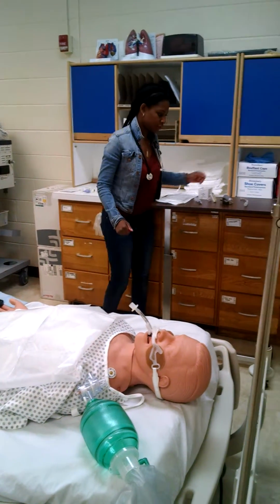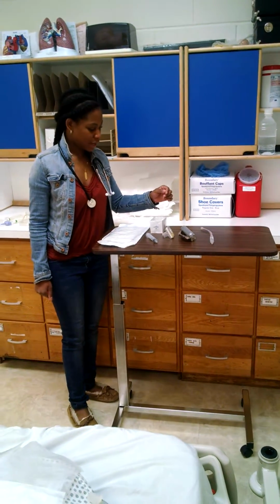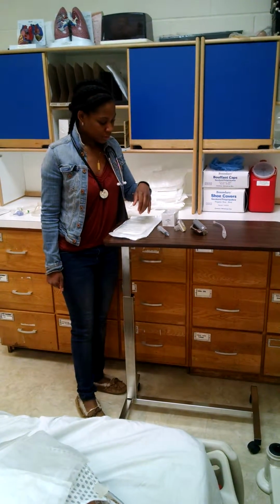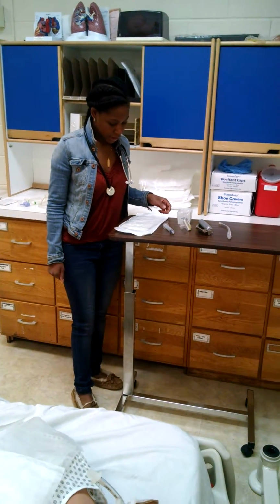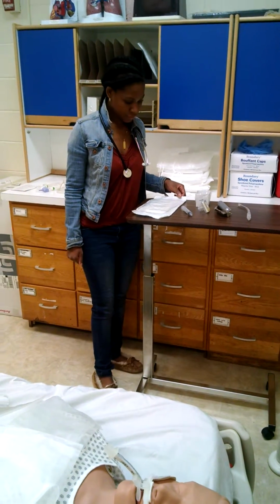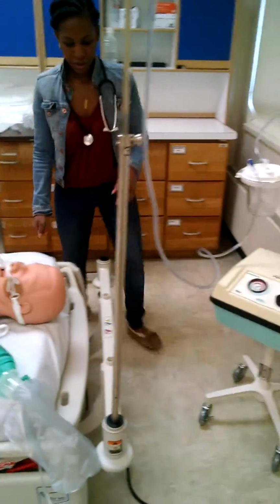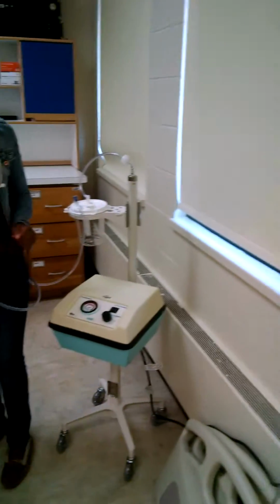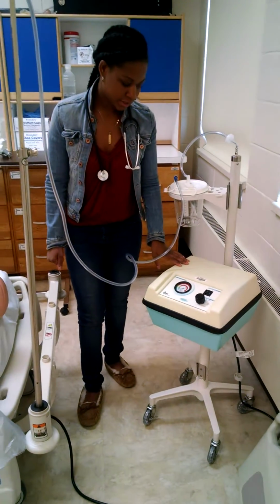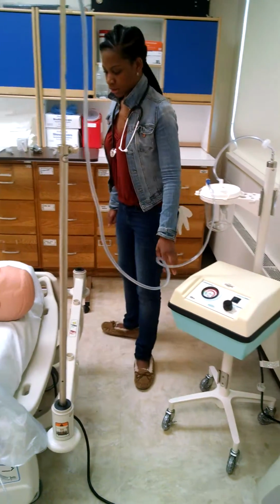I've gathered my necessary equipment, which includes a laryngoscope, my stylet, my CO2 detector, my Yankauer, my container with sterile water, and my suction catheter and gloves. I also have my manual resuscitator and my oxygen flow, and I have a vacuum which I set already at negative 120 to negative 150 millimeters of mercury.